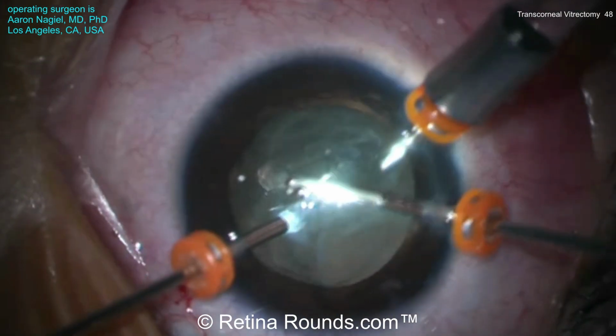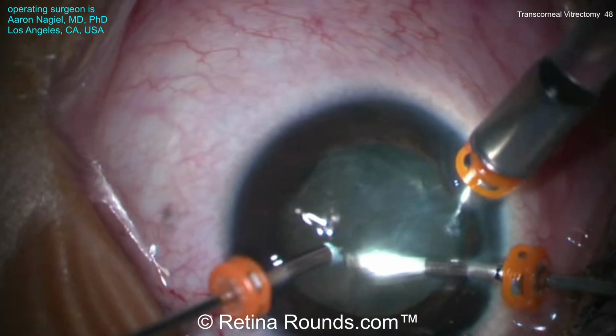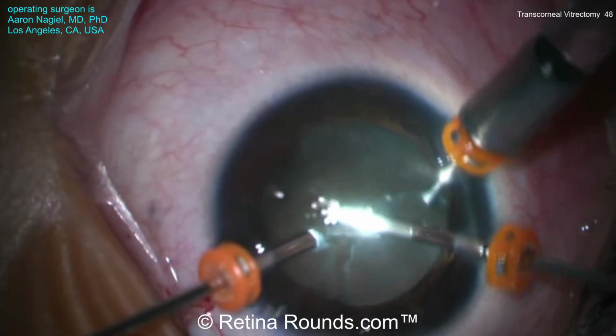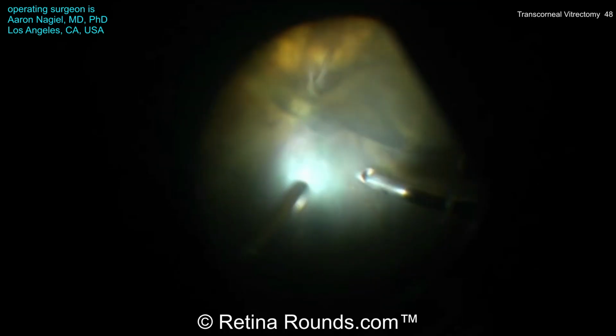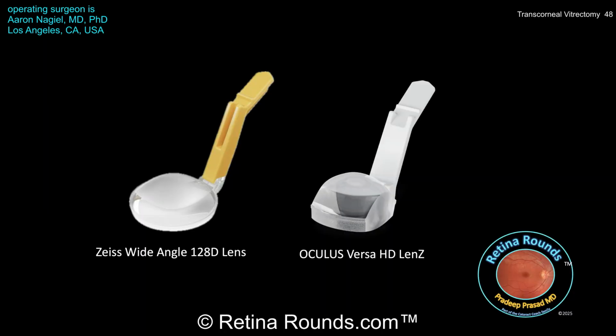Now we'll show you the video for the patient in this case. You can see that the 3 trocars have been placed and a 23 gauge cutter is being used to perform a lensectomy. Once the lensectomy is performed, the instrumentation can then be directed towards the posterior segment to perform the retinal detachment repair. And you may be wondering, how is it possible in a pediatric eye, where the instrumentation is already fairly crowded, to also take a vertical approach and still maintain wide-angle viewing?